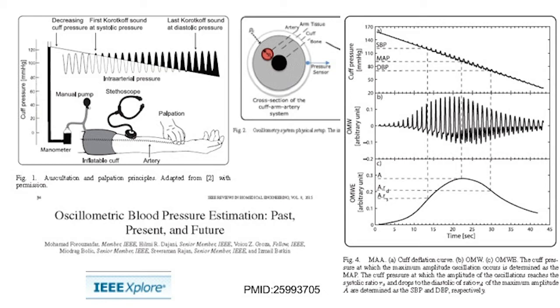There are at least 7 different ways to take that waveform envelope and translate it into systolic and diastolic pressure. You know, part of this was driven by Leslie Geddes from Purdue, but others have done this as well. And when you have the mean arterial pressure here, you just backtrack a certain percentage here and say that's systolic, and you forward track a certain percentage and say that's diastolic as the thing deflates. So once you see the mean arterial pressure is 98, and you know the front end and the back end of that, it'll spit out a number here based upon a fixed percentage. This is just one way of doing it.